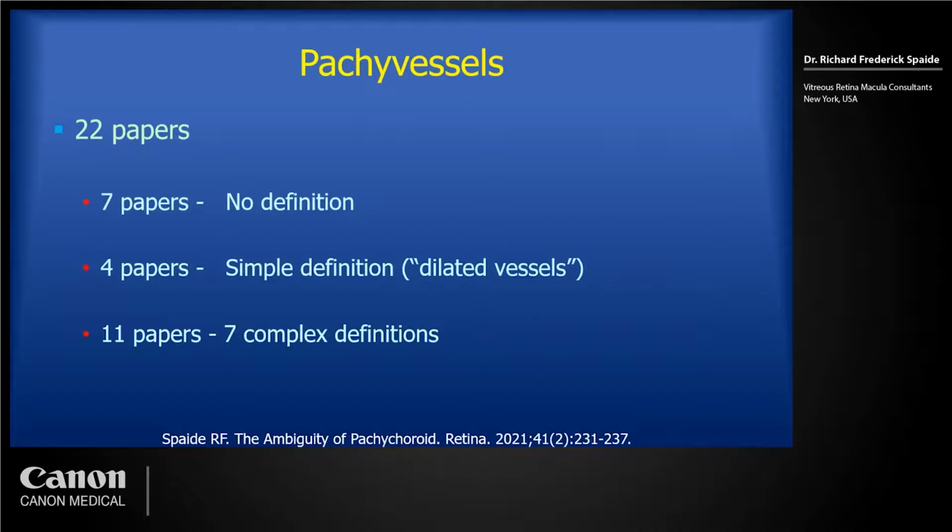Pachyvessels were stated to be an important component of pachychoroid. I looked at 22 papers concerning pachyvessels. 7 papers had no definition at all. 4 papers had a simple definition of just dilated vessels. 11 papers had 7 different complex definitions for pachyvessels.